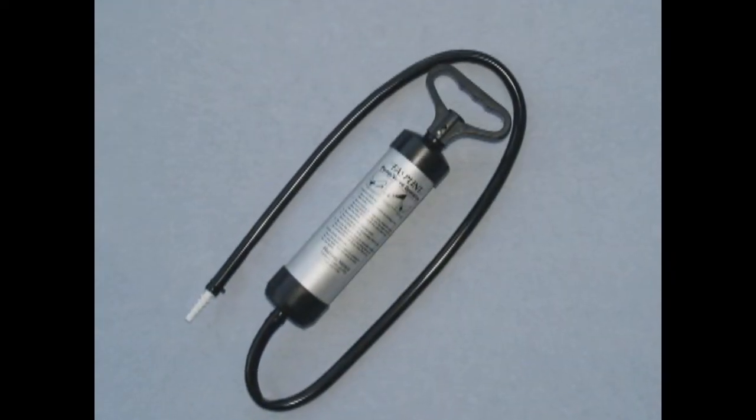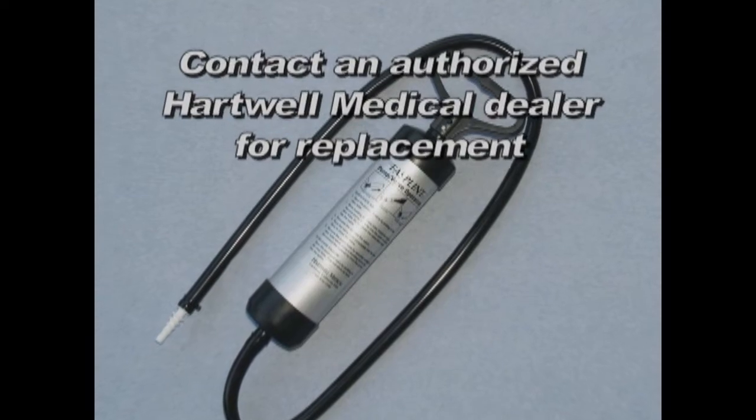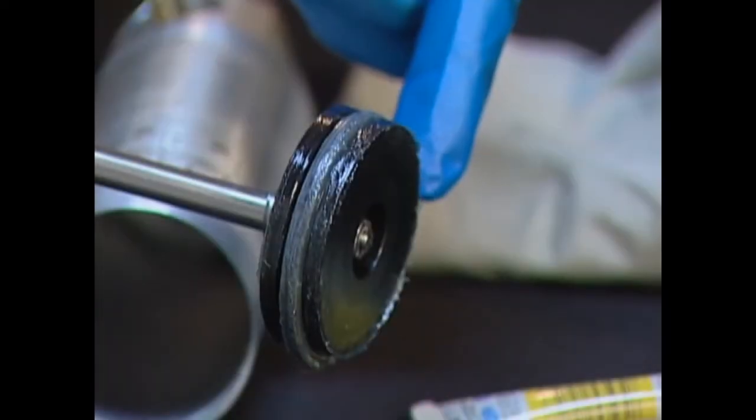The plastic pump does not require any maintenance. Contact your authorized dealer should you need a replacement. The all-aluminum pump is virtually maintenance-free. Perform general exterior cleaning as needed.